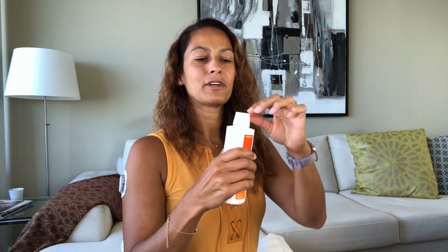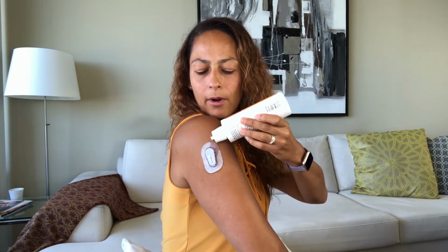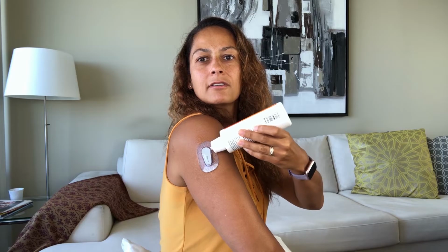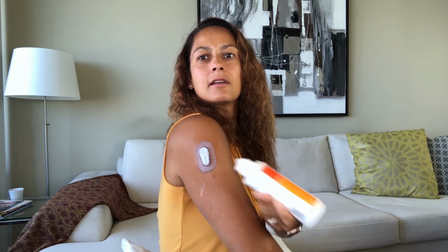So let's do it. Get my glue remover, open it up, and I simply pour. You can see the color of the tape of the sensor changing. There we go. This is just, it's absorbing. If anything goes running, just dry it off. That was step 1. Now we wait.